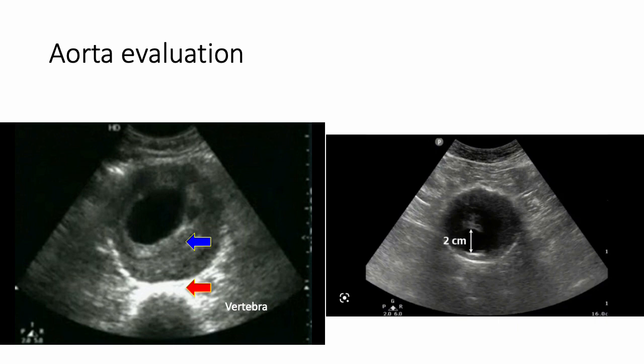These are 2 examples of very large aortas, both that have thrombus circumferentially around the still patent aortic vessel, and so you can see how they are very large. They come into view quite easily, and sometimes you lose sight of this in some bowel gas, but they can be somewhat short. So it is important when you're looking to scan all the way down through the abdomen, and if you do that and you don't see any large vessel, then you can likely move on.